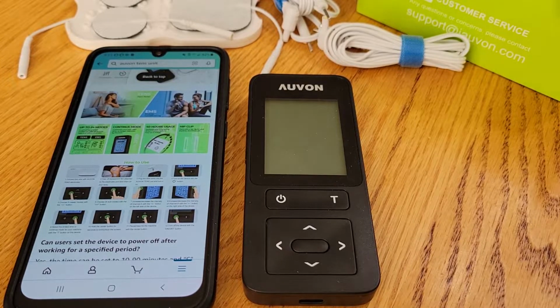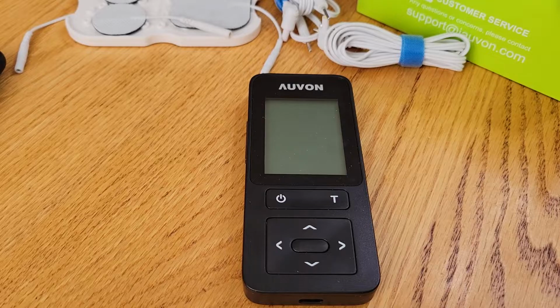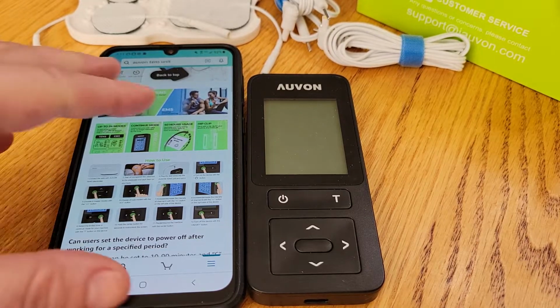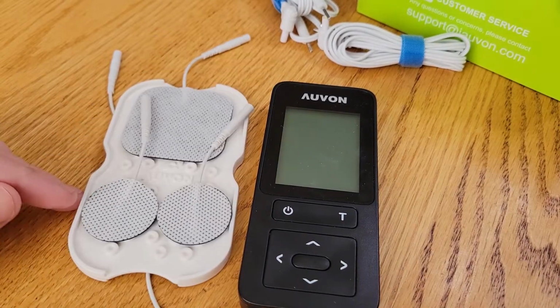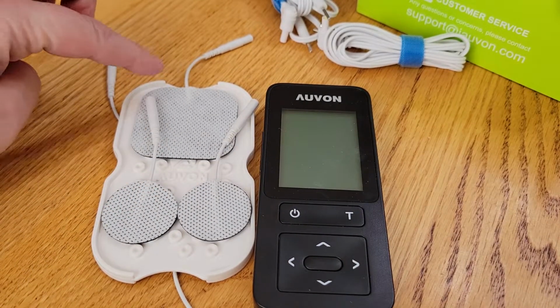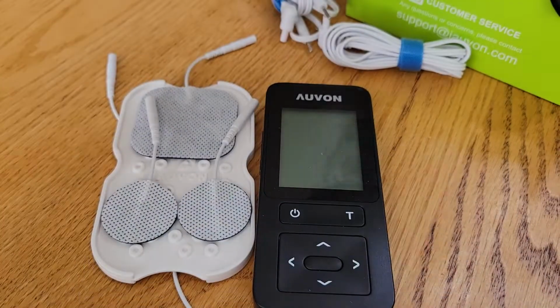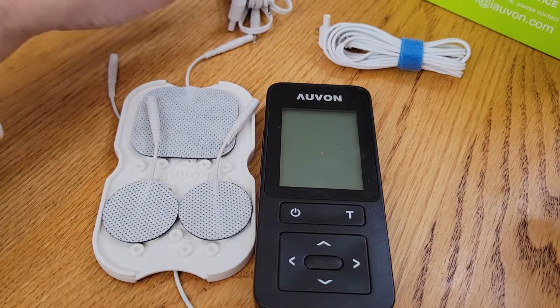But today I'm just going to show you how to quickly set up your TENS unit, and also show you in relative size what the size of your unit should look like when it comes. So first of all, there are circle pads that come with this unit, the square pads, and then there are some larger pads such as this. But just to show you today, I'm going to use these small circular ones.